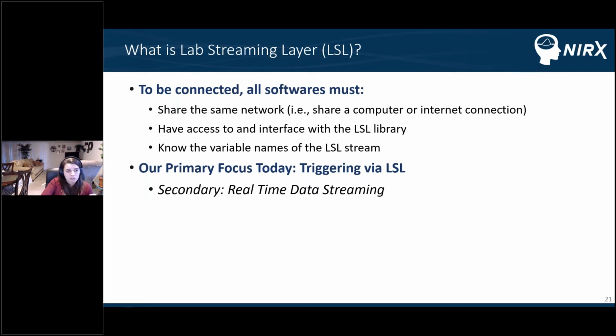All software must also know the variable names of the LSL streams, as we'll see in the hands-on portion. As I mentioned, LSL does a lot, like collecting data from various sources and encoding them. But our primary focus today is going to be triggering via LSL. We're also going to touch upon real-time data streaming, because they are two things that are readily available with NIRx software.